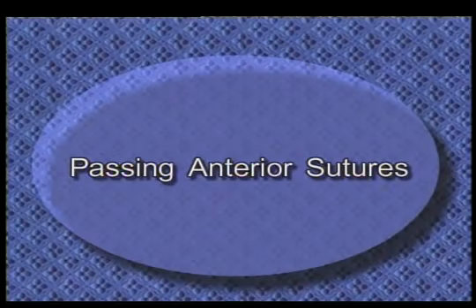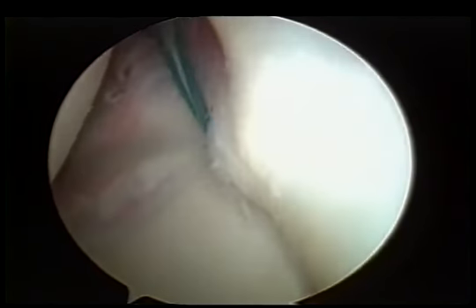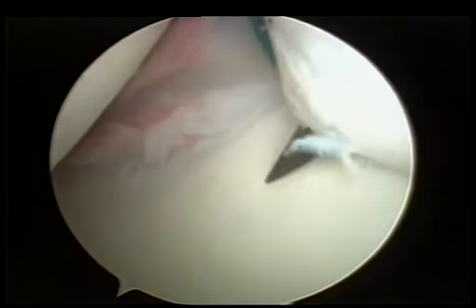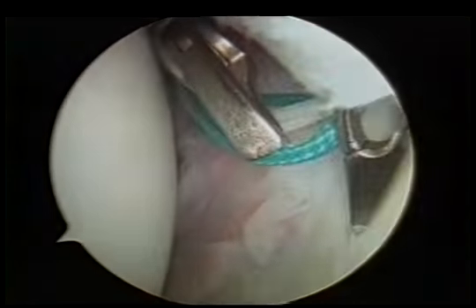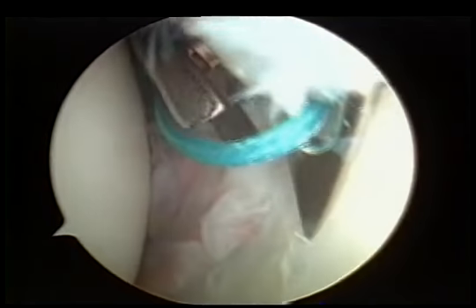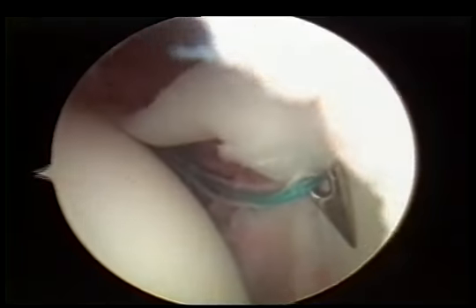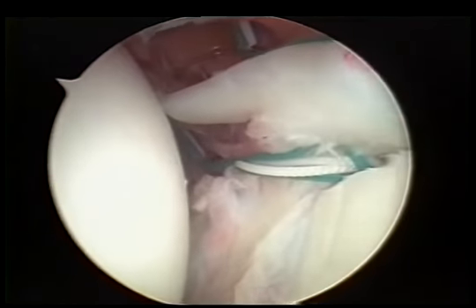Next, we'll pass our anterior sutures. This one is also doubly loaded. We'll use our 45-degree or 22-degree bird beak to pass one to anchor the root of the biceps. We'll pass this through the labrum at the base of the biceps. And the loop of this suture as it's tied is going to come over the posterior half of the biceps. This is the most critical suture.